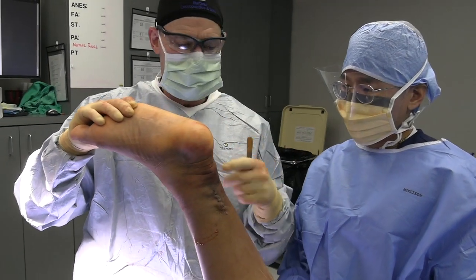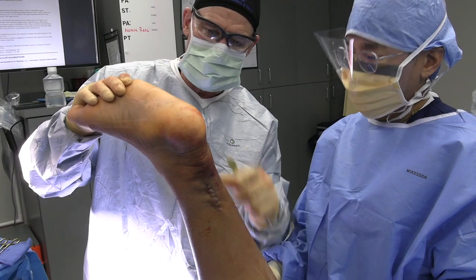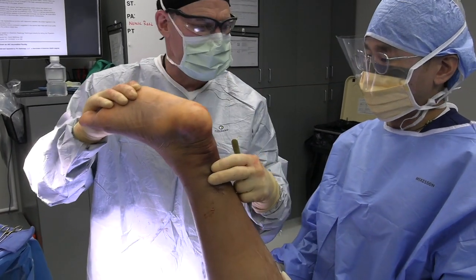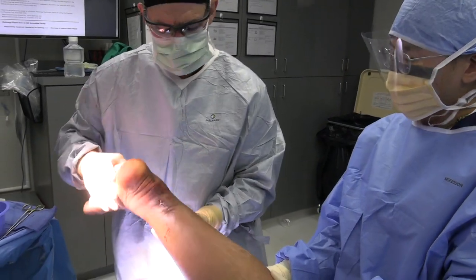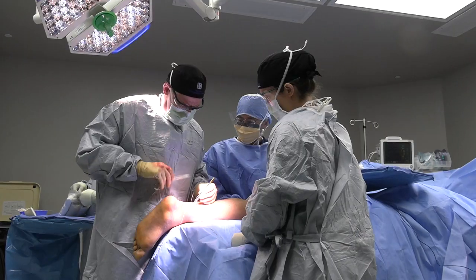Usually by the time you come back to the first post-op visit in about five days, we take the splint off. As soon as you can get his heel on the floor and have it flat, then we put him in a cast. A lot of weight-bearing is tolerated. Without doing this technique, people can't be weight-bearing for long periods of time. We may help get the steri-strips on.